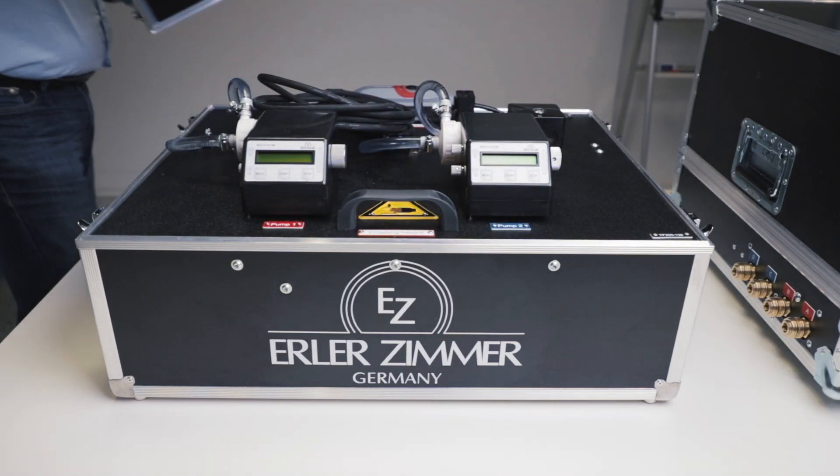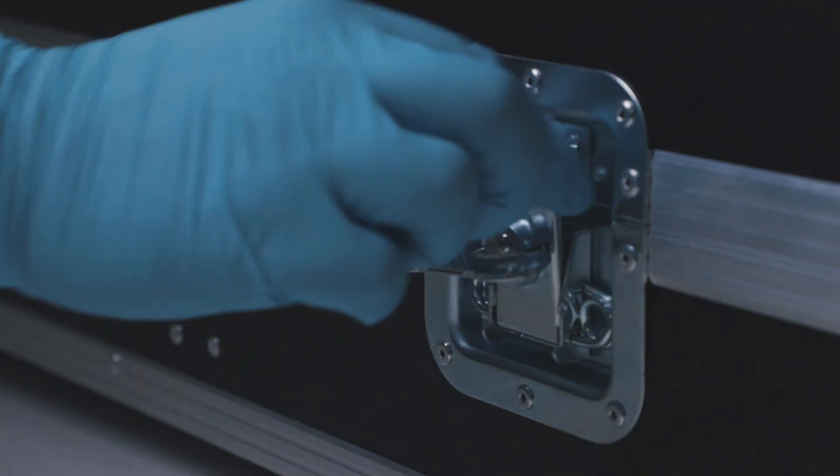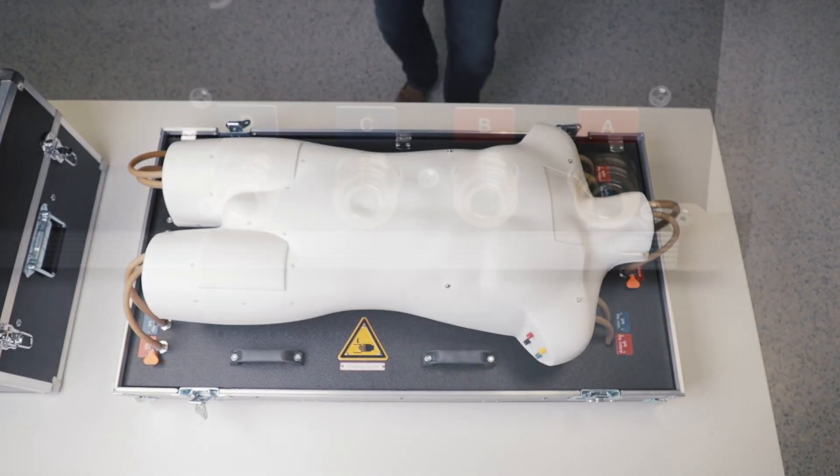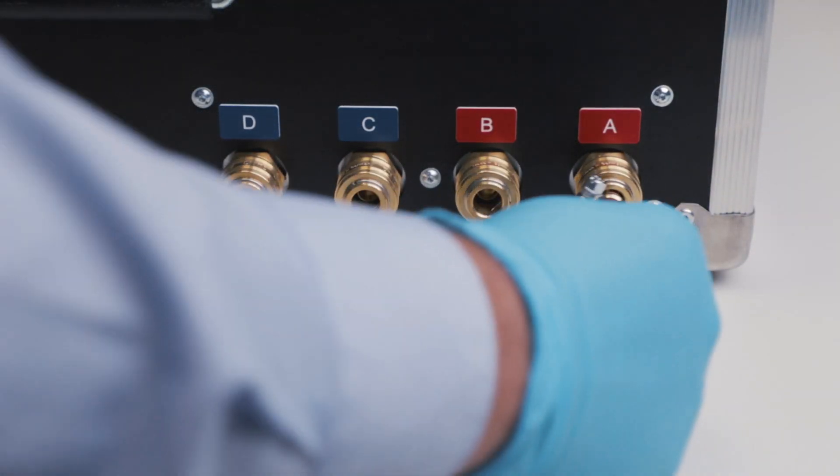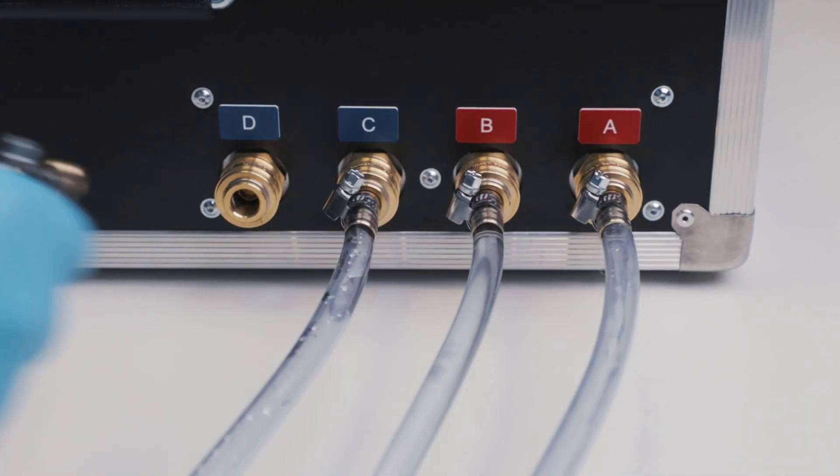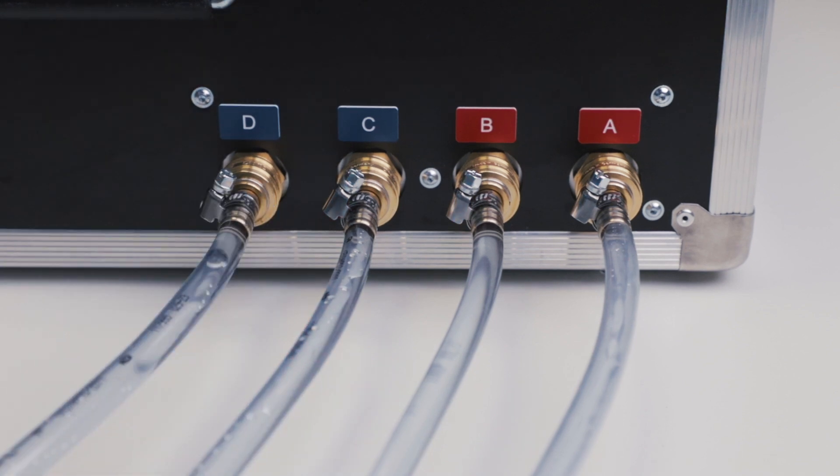The small one is the pump case. The bigger one is the body case. There are clear tubes that connect the two cases. Outlet A is connected to outlet A, B to B, C to C, and D to D.